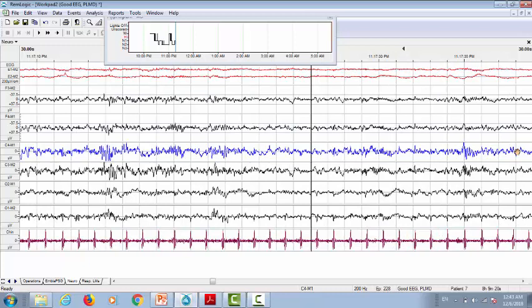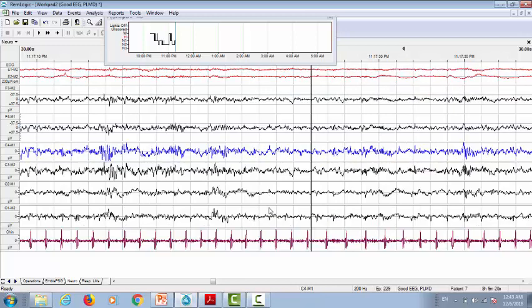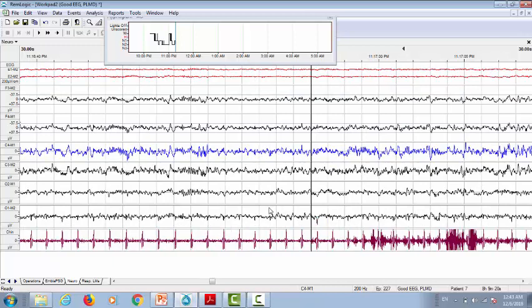There is no clue here. We go forward. So this is phasic REM. Here we started to have rapid eye movements. Tone is absent. So this is a definite REM episode. We go backward and we score loose, tricky epochs as tonic REM.